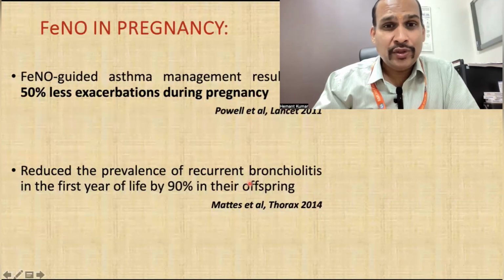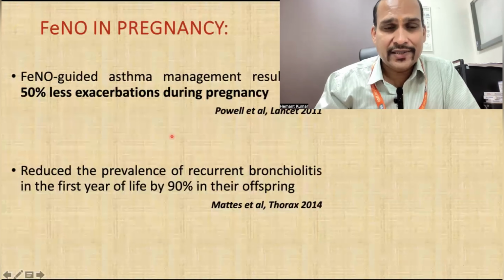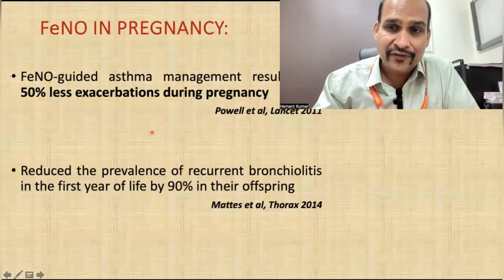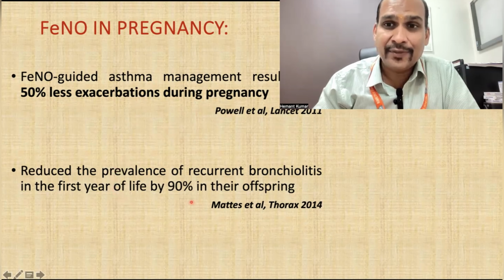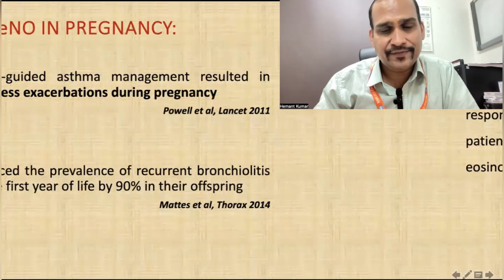What is the role of FeNO in pregnancy? If you treat asthma in pregnancy with FeNO guidance, there would be 50% less chance of exacerbation during pregnancy. So it not only helps the pregnant lady but also her baby. There will be a 90% reduction in recurrent bronchiolitis if you treat the patient under FeNO guidance.